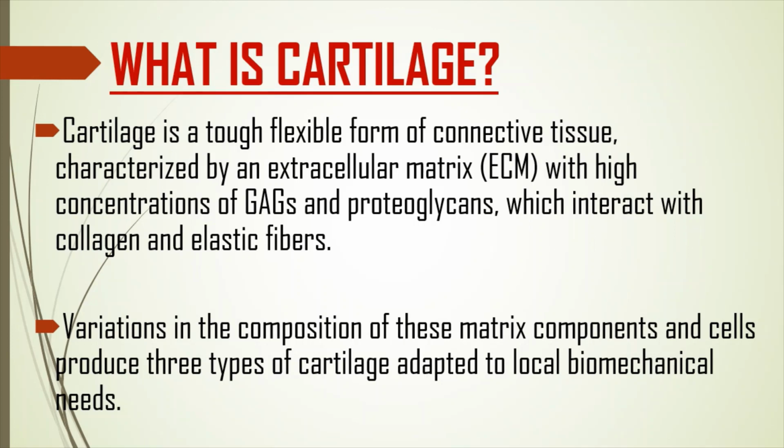So we must know that cartilage is a specialized connective tissue, which is characterized by an extracellular matrix, denoted as ECM, with high concentrations of glycosaminoglycans, which are GAGs, and proteoglycans, which interact with collagen and elastic fibers.